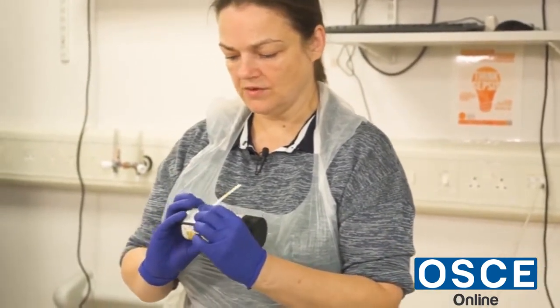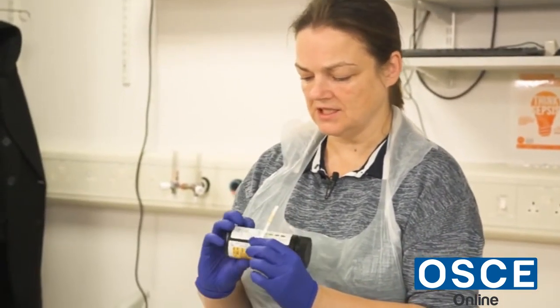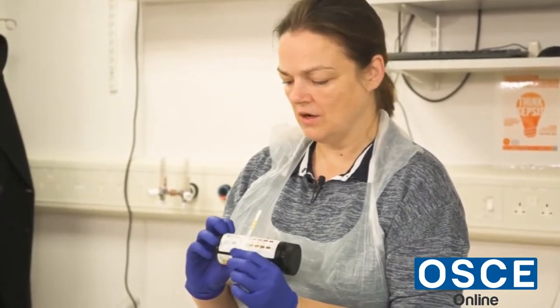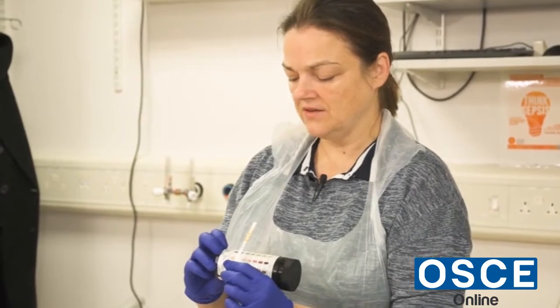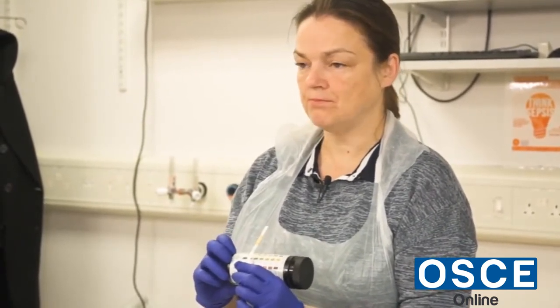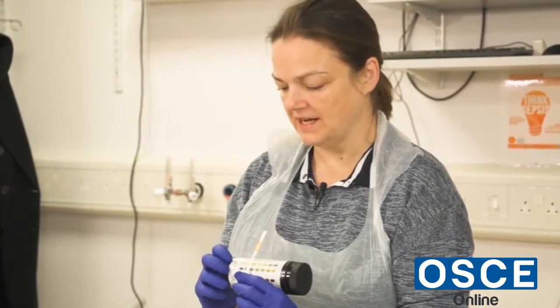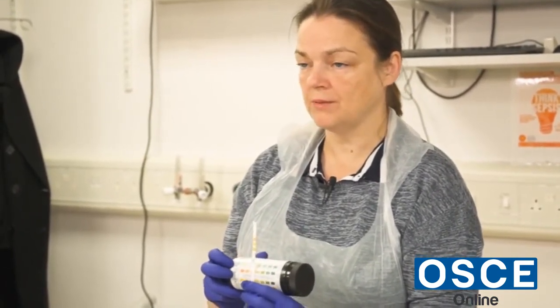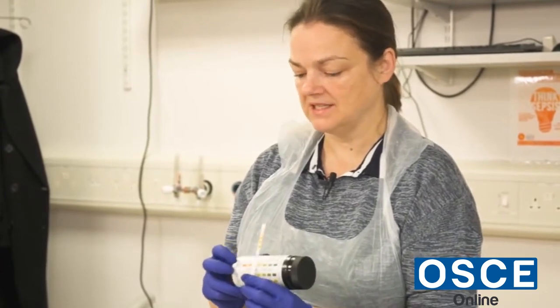And the first one says glucose, and it says 30 seconds. The second one says ketones, KET, which is 40 seconds. Then it goes SG, specific gravity, 45. And it says BLO, blood, 60 seconds. pH, 60 seconds. PRO, protein, 60 seconds.